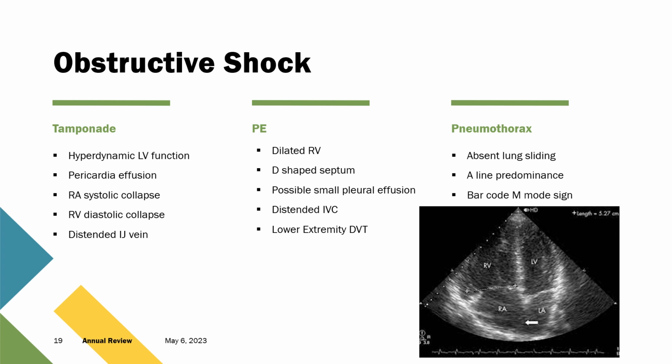And in the case of a dilated right ventricle, you may identify a D-shaped septum where the pressure increase in that right ventricle is significant enough that it's actually causing deviation of the interventricular septum. Again here, this is going to cause congestion of the right heart, which will then back up into the IVC. So you'll expect a distended IVC that does not demonstrate phasic changes.